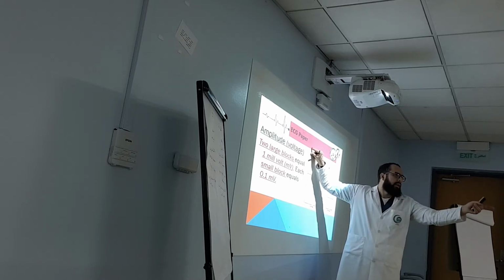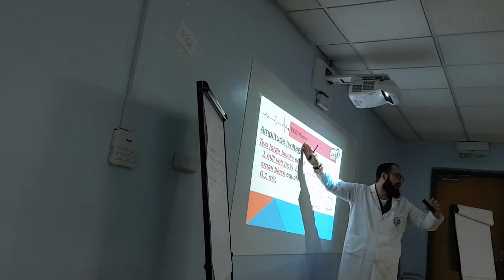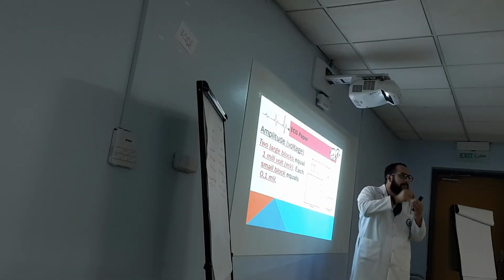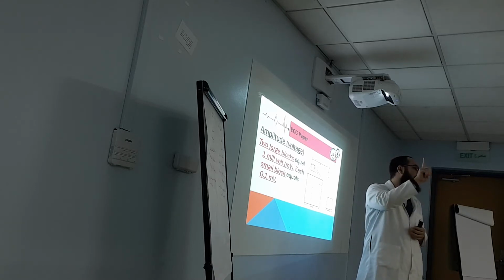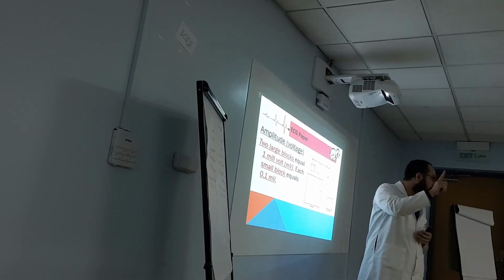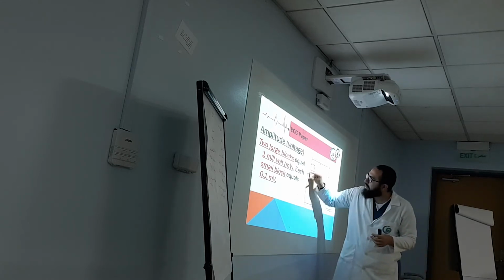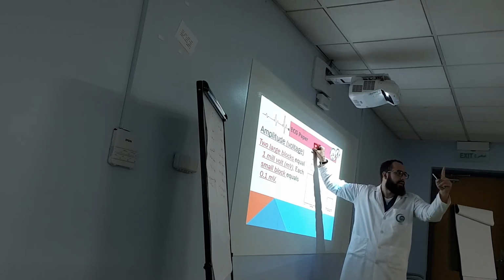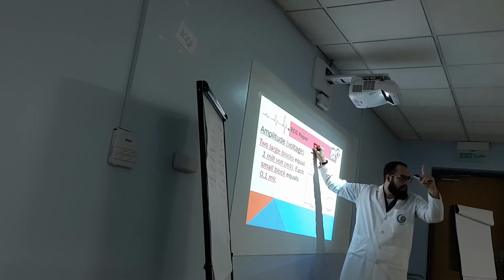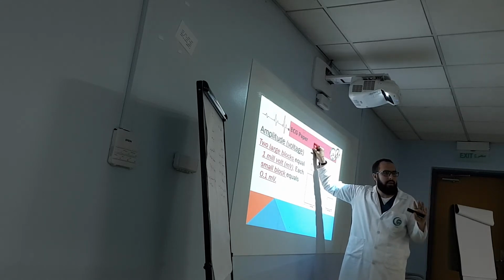1. If it is 10, the 0 will be on this side and the 1 will go to the other side. Okay, this point means the fractions. Now you have a whole 1. Okay, you get it, guys? So you need 10 small squares to have 1 millivolt, okay? Anybody don't get it now?